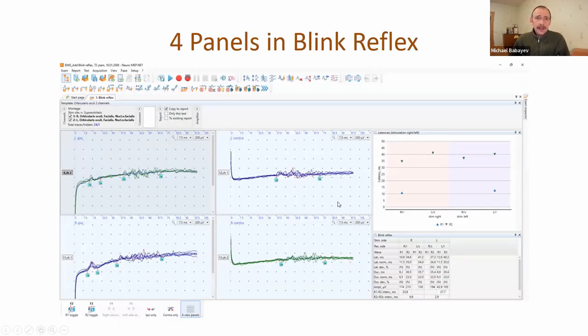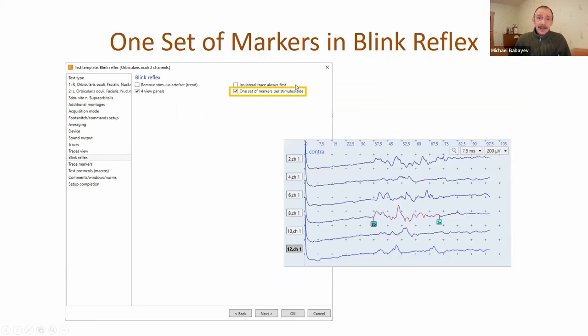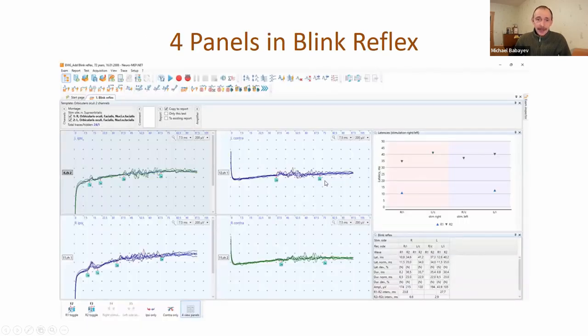Now we added a special four-panel mode for blink reflex. Because we have two recording sides and two stimulation sides, it's possible to put traces in four panels. We also added a checkbox - one set of markers per stimulus side. If this checkbox is checked, you will have only one set of markers in one quadrant, and if you place another marker in any quadrant, the previous one will be removed. This makes it very easy to analyze data.